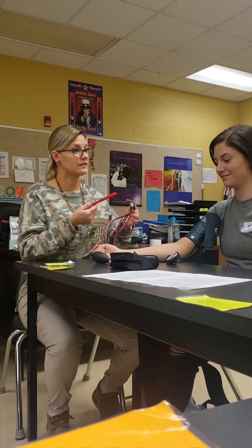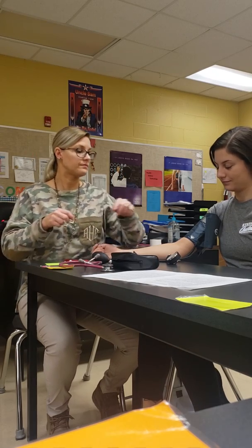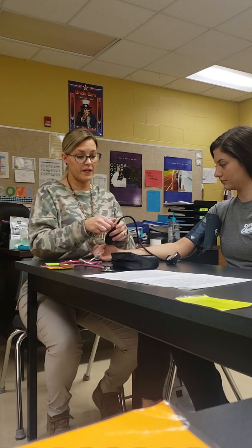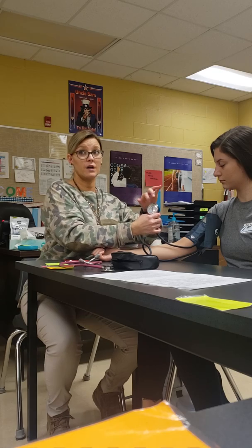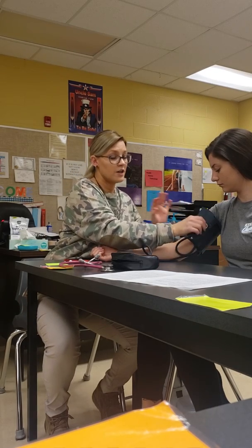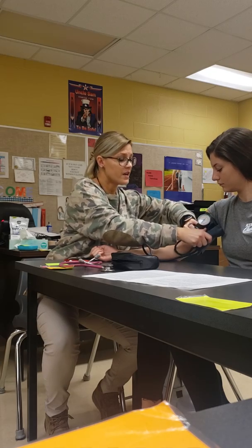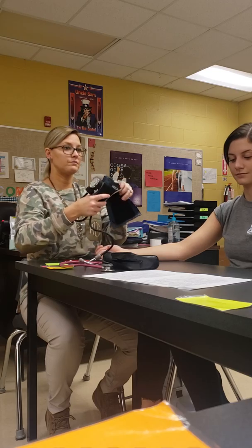Good. Deflate the cuff completely and remove it from the resident's arm. So I've deflated the cuff. I let all the air out as soon as I heard that last beat. I finished deflating the cuff. Hook this back on because we don't want to break this. You're not just going to rip it off. You're going to support it here because that Velcro is pretty tight, and you're going to take it off.